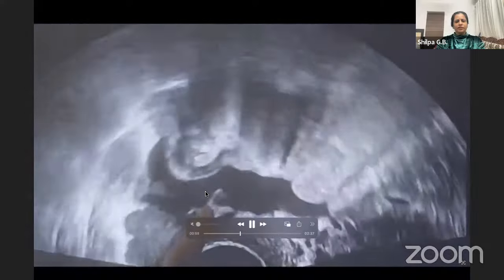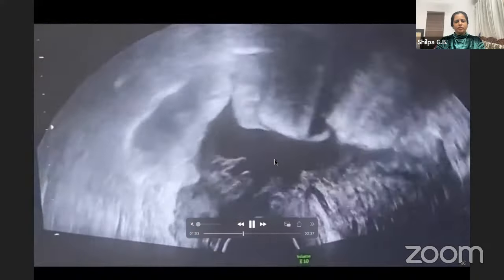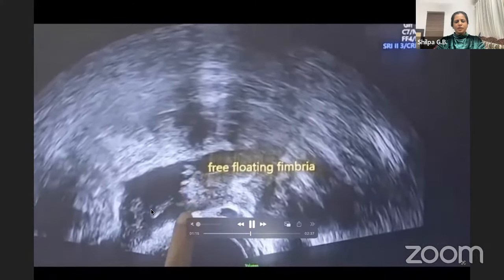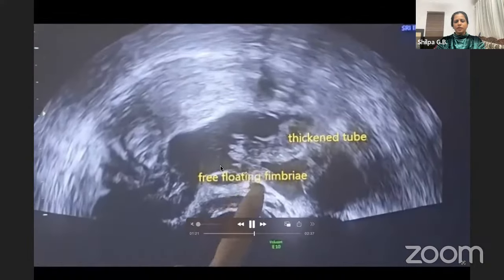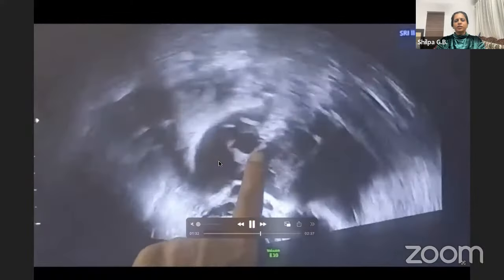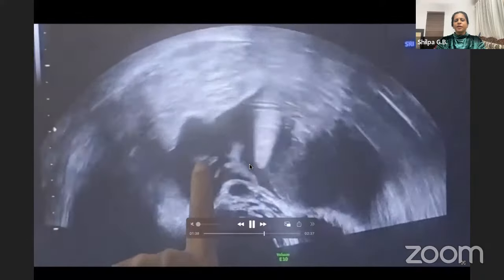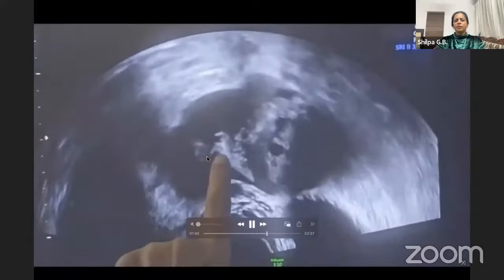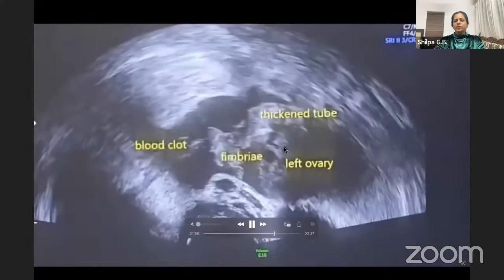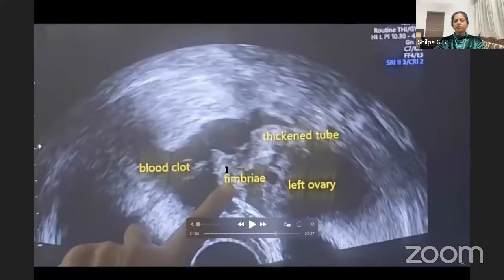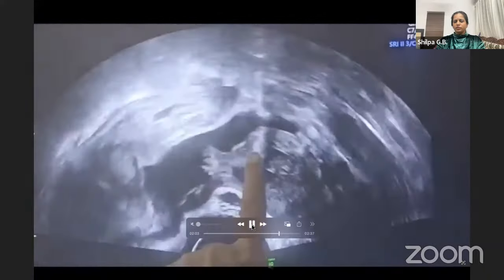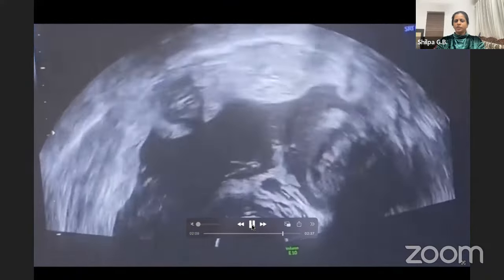Here is the ovary and you can see the fluid in the POD. This is the fimbria - you can see something coming out of the fimbria, which is blood and blood clot. This is the thickened tube, the free-floating fimbria. This is classic of tubal abortion where the products of conception are expelled through the fimbria into the peritoneal cavity with a lot of blood in the peritoneal cavity. These are the blood clots, the fimbria, the thickened tube, and the left ovary.